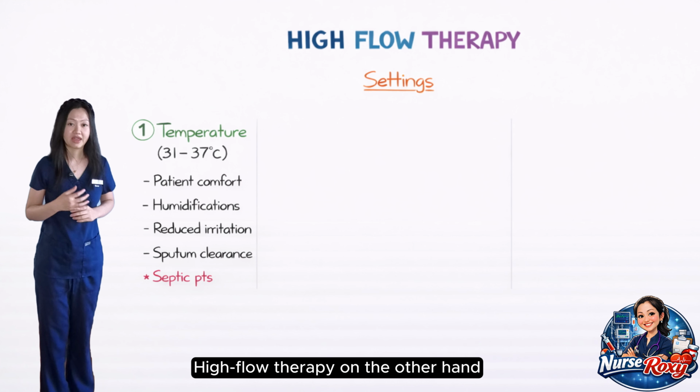preferences. In saying that, be mindful of setting a high temperature for septic patients or patients who have got some sort of infection, because if their body is already febrile, adding extra heat can worsen their body temperature.